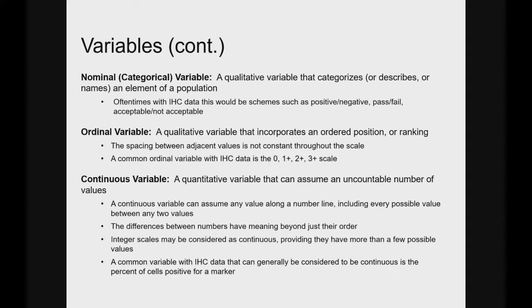Ordinal incorporates this idea of ranking, ordered position, and that's where we get to this 0, 1 plus, 2 plus, 3 plus scale. Okay, the order of those has meaning. 1 means there's more of something than 0. 2 means there's more of something than 1, and so forth.